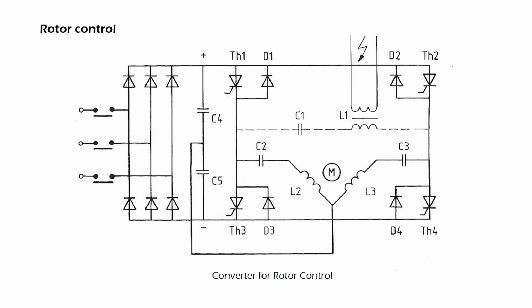A contactor provides for changeover at the end of the preparation. The capacitors C2 and C3 and the inductance L2 and L3 are switched off. C1 and L1, that is, the high-tension generator, are connected in the circuit instead. Now the converter is ready to generate high tension. At the end of the exposure, that is, the generation of the high tension, the contactor changes back to the rotor control circuit for braking the rotor and standby condition.